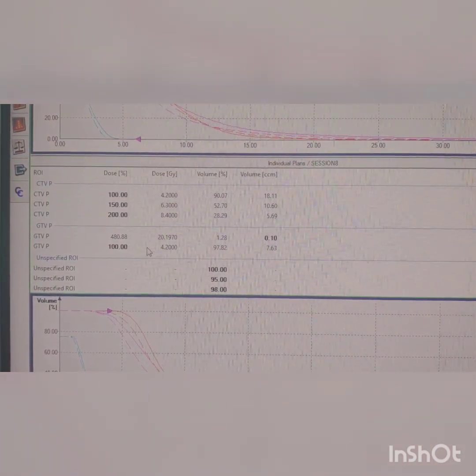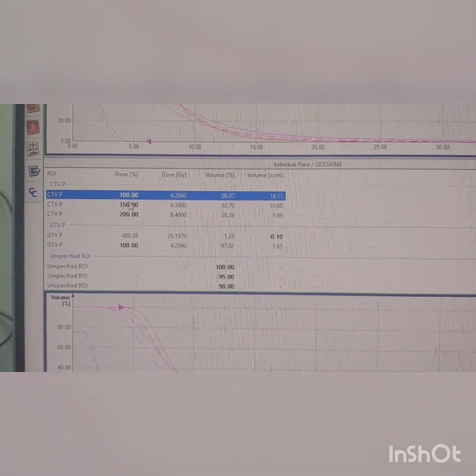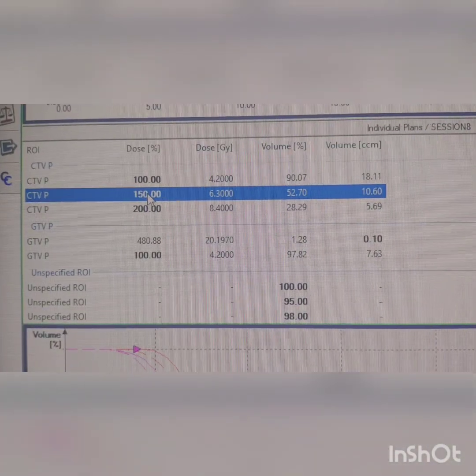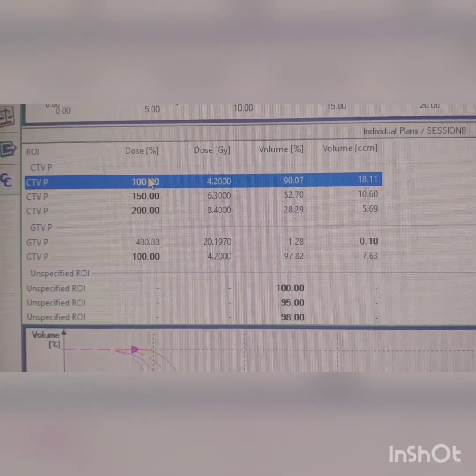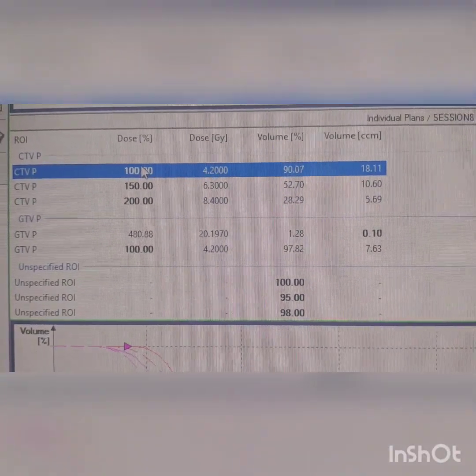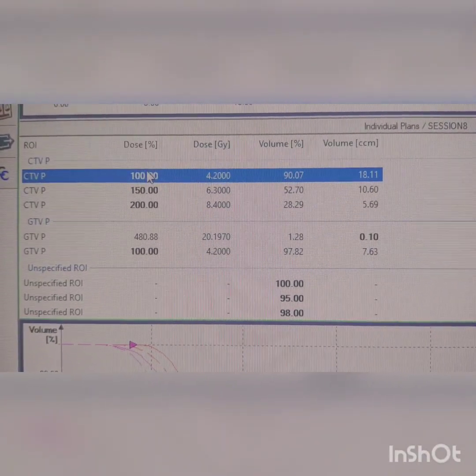The DNR ratio is the ratio of the 150% isodose volume to the 100% (CTV) volume. For example, if the 150% volume is around 52 and the 100% volume is around 90, the ratio is approximately 0.4 to 0.5. The DNR ratio should be 0.4 to 0.5.